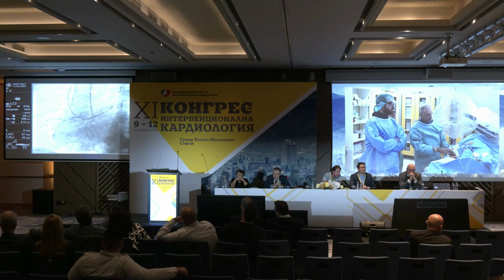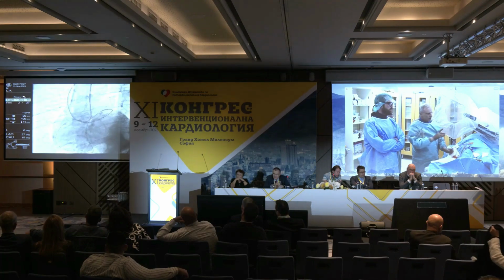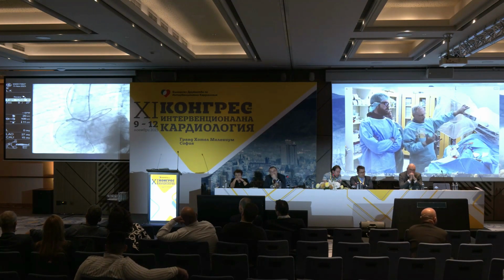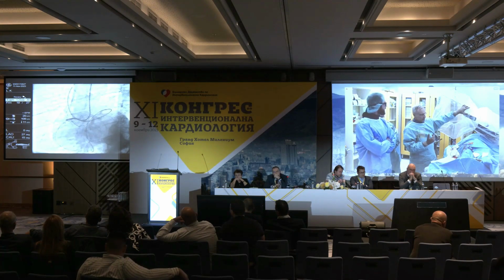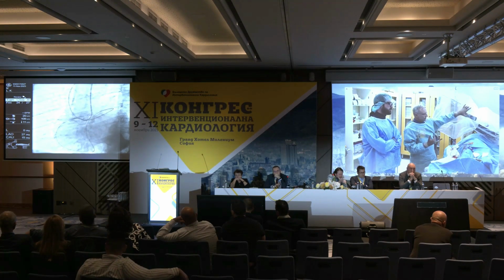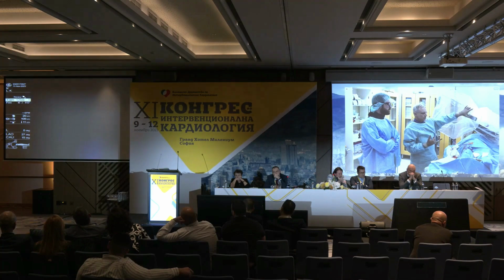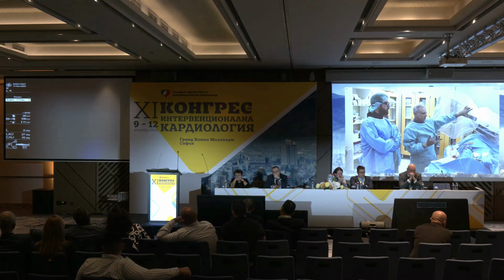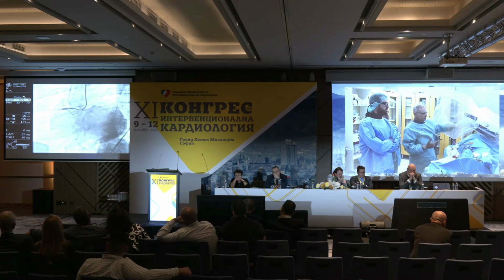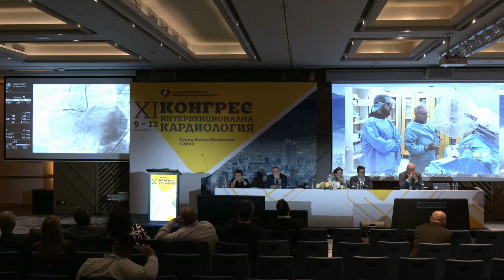First of all, I would like to show you one thing. See that one? You see that the crossing of the retrograde wire is completely in the inferior part, on the inferior rim of this right coronary. And if you do an antegrade attempt, let me just see if I have to show you the wire crossing here. All the anterior crossing here, look at that. It was puncturing completely into the wrong direction. And that's exactly what I had in my mind when I was doing the antegrade.